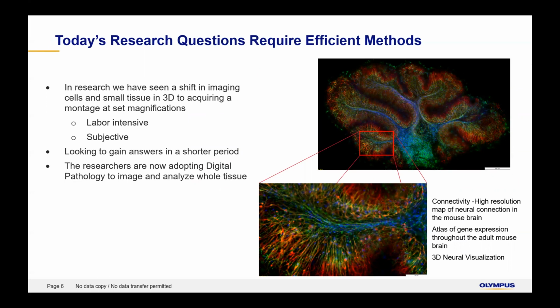No longer is a whole data set represented by a few representative images, but all the data can be preserved. From a very practical standpoint, this means that slides no longer must be physically stored for long periods of time. Information is no longer lost if a slide is damaged or disposed of. It also facilitates the sharing of data across distances, whether for remote diagnosis or for long distance or more recently socially distanced collaborations. Digital preservation of slide data removes the limitations of having to be physically near the slide in order to work on the data.